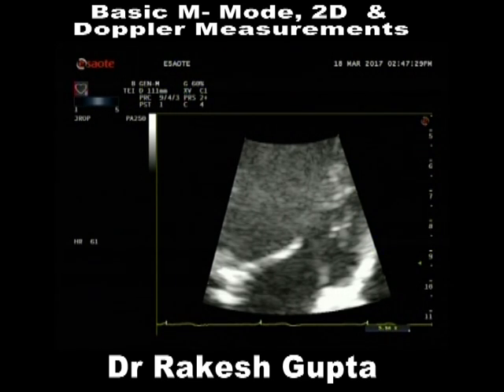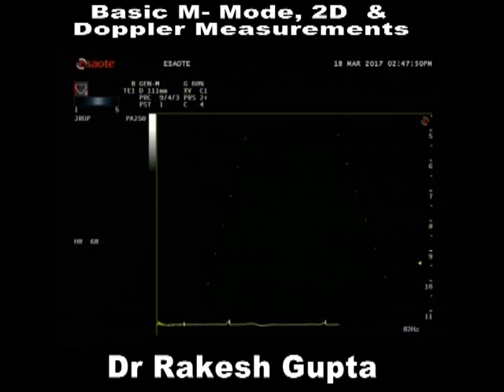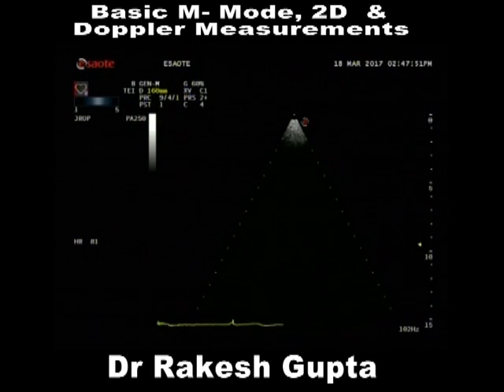Frame rate means higher the frame rate, better is the quality. I gave an example for pixel: higher the pixel, better is the camera photograph. It's an inbuilt one. We can go as high as the frame rate is. Look, that's another good question. This is what the frame rate of this machine is, 102, correct? How much maximum frame rate can I take this machine to? Let me try.